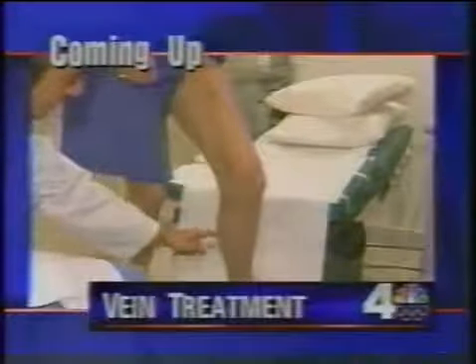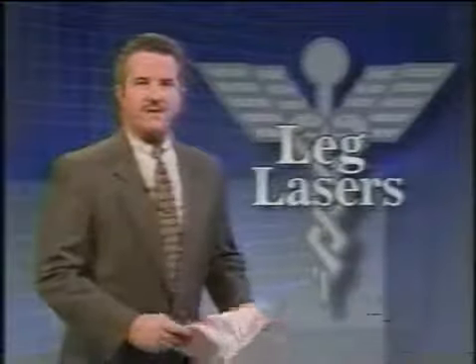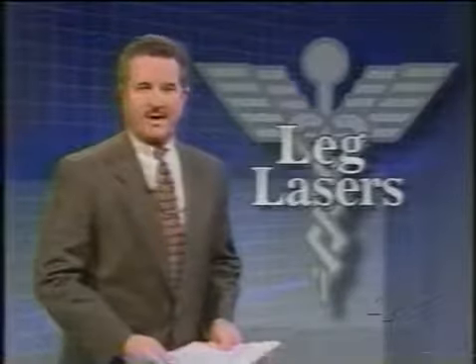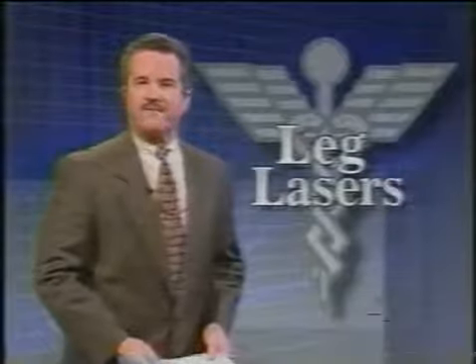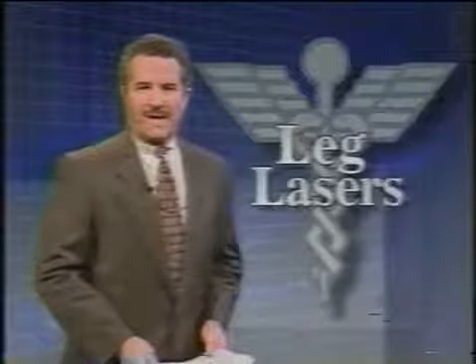Also, a new laser treatment for varicose veins. Later, a new laser treatment for those unsightly and painful leg veins, varicose veins. Well, if you suffer from varicose veins, you probably know that you can have them injected or lasered, depending on their size and location. But most big varicose veins come from the failure of a large vein in the groin, one that had to be surgically stripped out until now.